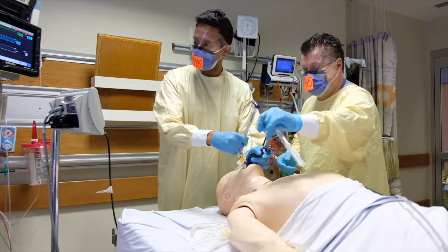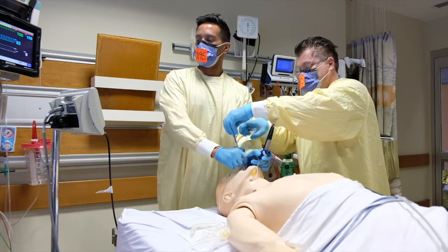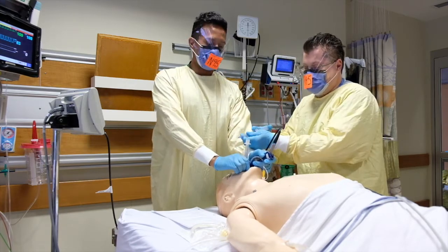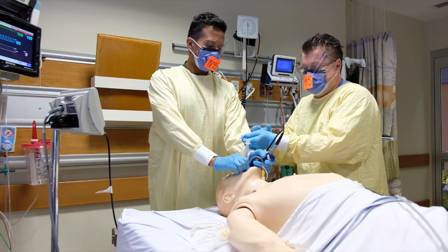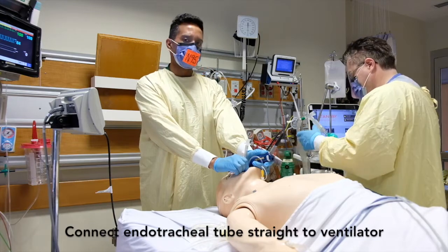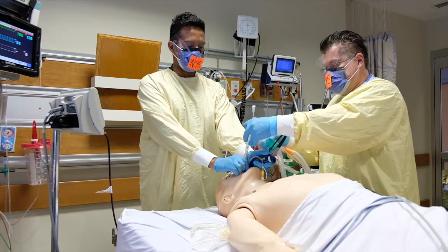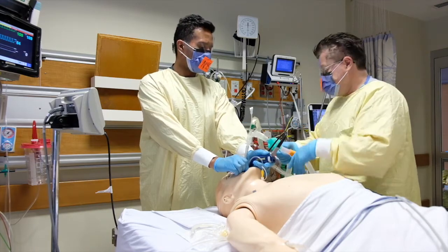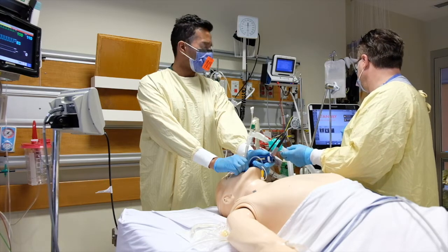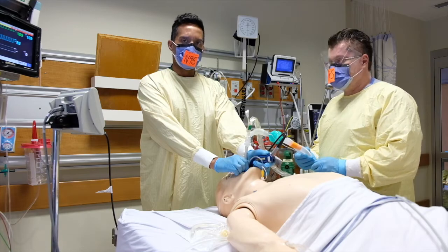And what we're going to do is we're going to go straight onto the vent. When we're done, you can take the stylet out, please. Thank you. And again, we have not bagged. We're going to put the cuff up, and we're not going to go onto the bagger. We're going to go straight onto the ventilator, and there's end-tidal CO2 hooked up on the ventilator. And then we're going to turn the ventilator on. This minimizes the number of disconnections in the circuit. And then the patient will have been intubated.